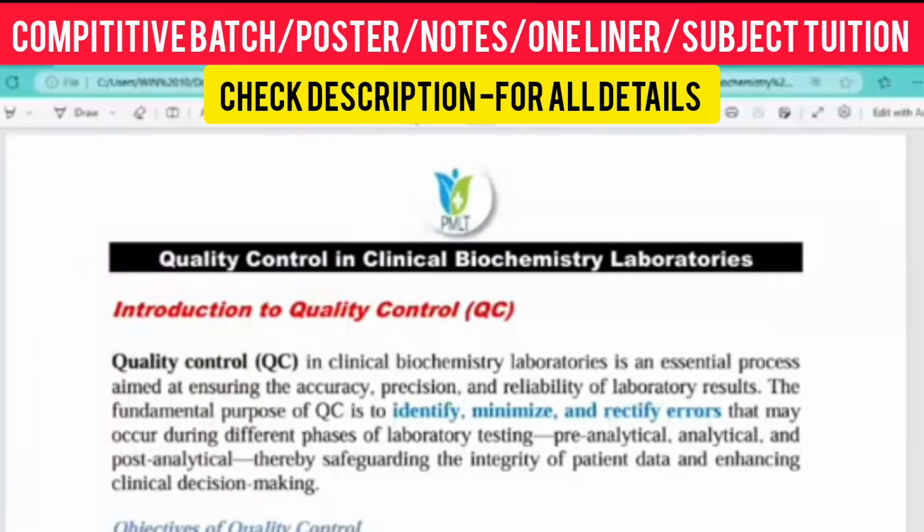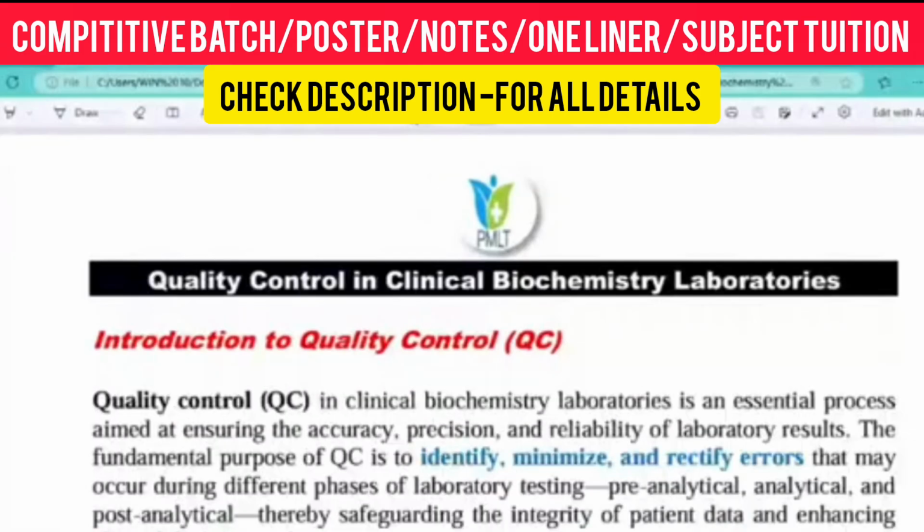Okay, we are starting today's class, that is quality control in clinical biochemistry laboratory. Basically, quality control is present in various laboratories, but we will understand it in the clinical biochemistry aspect: how quality control is happening, what quality control is, and what the objectives of quality control are. We will learn lots of things gradually. Just stay tuned with me.